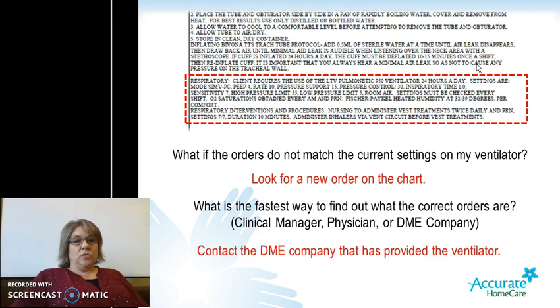In your Elsevier module, you will notice that it says several times that if the settings do not match, you are to change them to what the settings that are ordered and then contact the provider. At Accurate Home Care, we advise that you contact the DME company prior to changing any of the settings. We are not in the home 24 hours, and they may have come after hours and have changed a few things. We need to verify this before we assume that we should go back to the other orders.